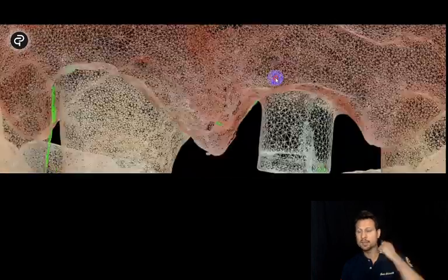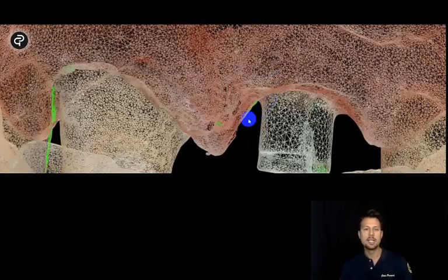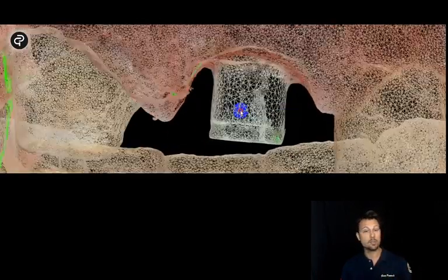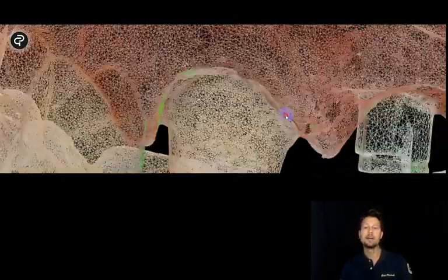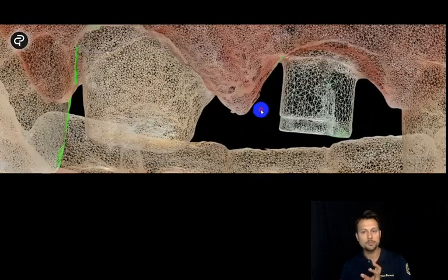It's not like I send the impression and then they tell me that it is not effective, or I take the impression and then there is a rotation of the transfer. We see immediately where there are some green zones, we need to rescan. So we just go back and do some extra scanning that takes just a few seconds.